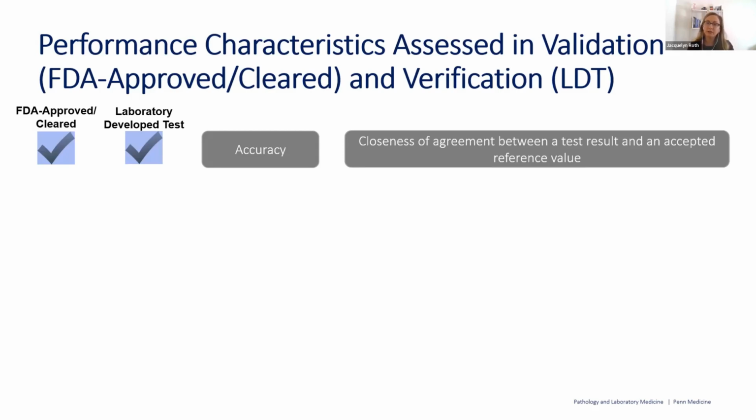So you would essentially obtain either samples or reference materials that are positive for what you are looking for, such as an IgH rearrangement or certain T-cell gamma rearrangements, let's say. They have their accepted answers or known truth, and you must test that your assay can detect it in just the same manner, if not better.